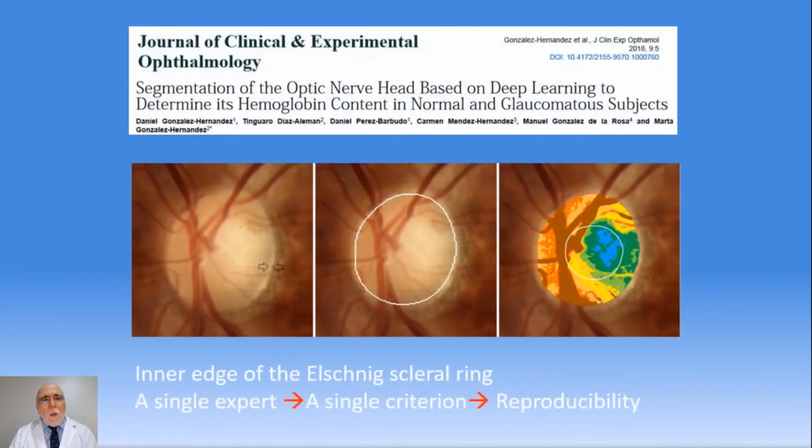periodic examinations. A necessary requirement for a method of image analysis to obtain reproducible results is that it should not depend on the subjectivity of the examiner. To achieve this goal, we have applied artificial intelligence methods known as deep learning to automatically perform various tasks. Firstly, the location of the nerve in the whole image and the limitation of its edges is done completely automatically.